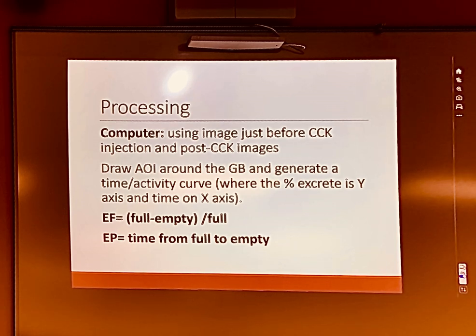And I make them do that because if your patient is doing this, none of your regions are going to be adequate, and depending on what kind of camera you have, you can't move the region. If you move it, it moves it for all 30 images, or all 60 images. So it just depends. It saves your bacon. I've also had to save my bacon on a gastric emptying study when we lost power. Somebody hit a pole out front. We lost almost the whole study. Well, we did lose the whole study except for the statics. So we were still able to tell him how much he was empty, which was a good thing.